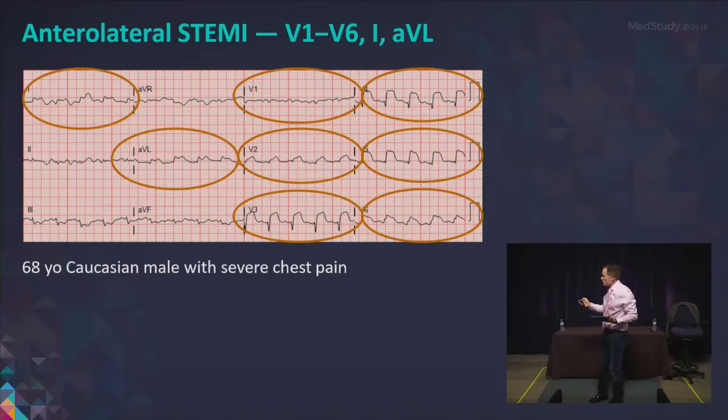And then does anyone know this particular change that he has here with big T waves and this big ST elevation? We sometimes call this something. Anyone got any idea? Starts with tombstoning, yes. It's called tombstoning because it looks like a tombstone. And as guardians of the medical galaxy, if you guys don't recognize this, then you'll be buying their tombstone. And you know those Italian marble imported ones can be quite expensive these days.